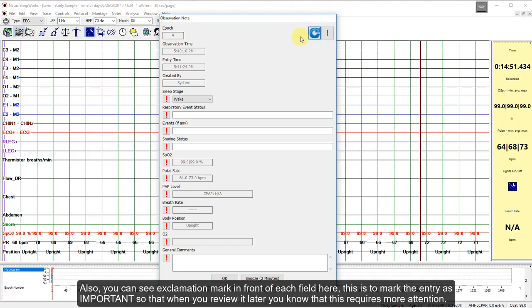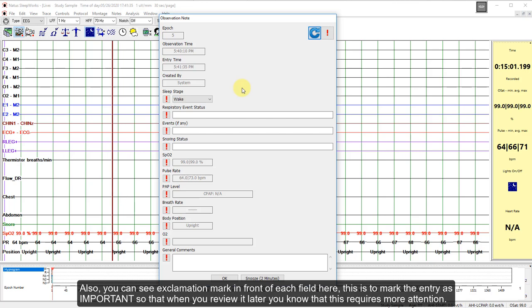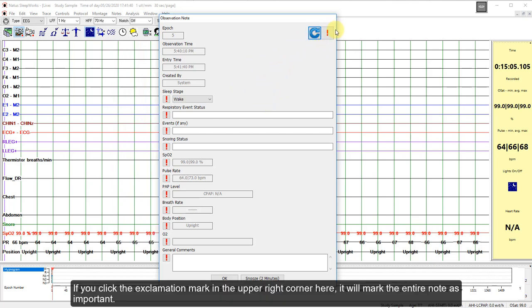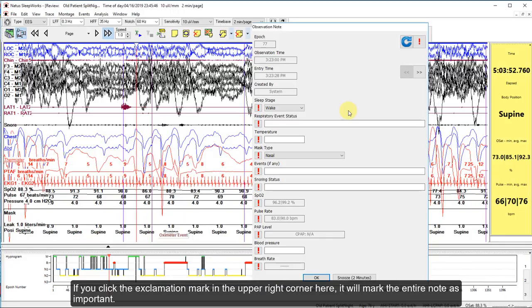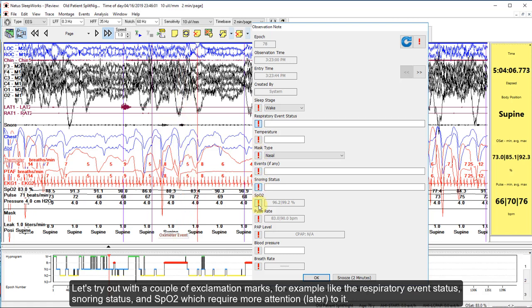You can see an exclamation mark in front of each field. This is to mark the entry as important so that when you review it later, you know that it requires more attention. If you click the exclamation mark in the upper right corner, it will mark the entire node as important. For example, I select the respiratory event status, the snoring status, and SPO2, which require more attention.